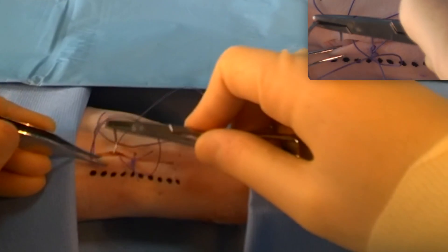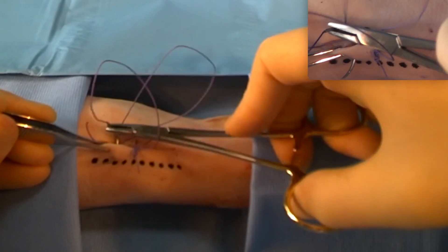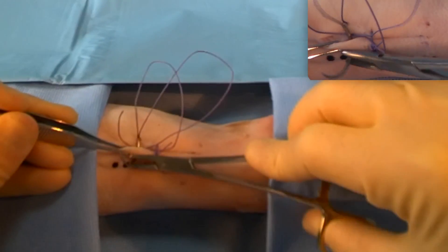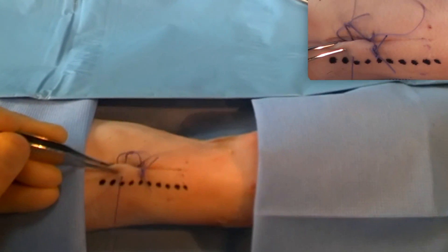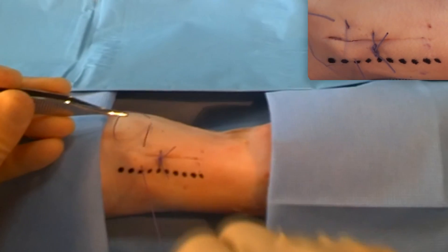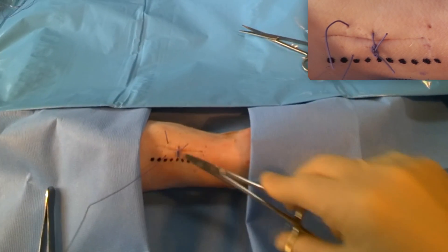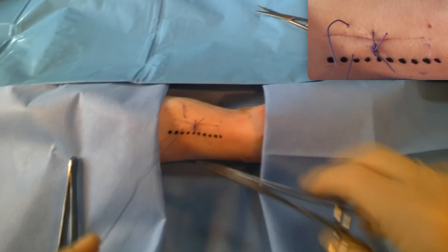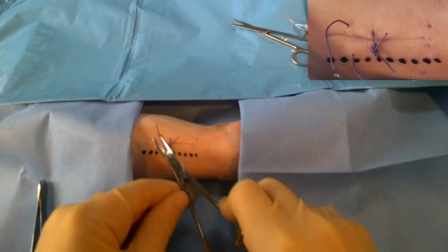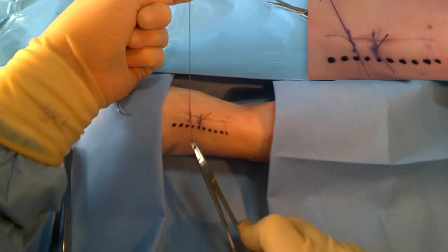Same thing coming out the other side, using the curve of the needle. You can see I'm using my left hand to manipulate the wound to make that easier for me. This time we're going to demonstrate how to do a needle tie. So we can see our short thread there, our long thread here. We're going to go one, two, in an upwards direction, pulling the short thread down and through.